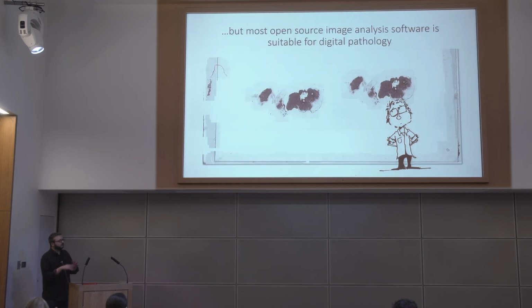So prior to that, I worked a lot with fluorescence microscopy images. I came up with ideas for how to work with them. They shouldn't be JPEGs. You need to store raw data, uncompressed, all that kind of stuff. I worked in the field of digital pathology then and discovered that the images were horrendous compared to everything that I wanted an image to be.